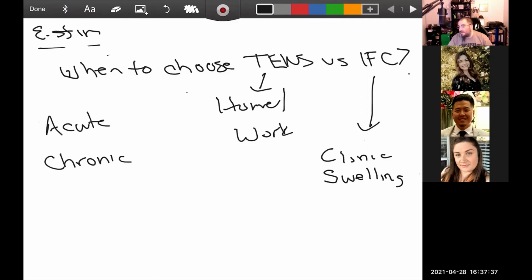So if you have an ankle and the only pads you have are big 2-inch pads, you theoretically could put TENS on with just two pads, or you can position them and move them around so you can get all four pads on. You get a little bit better result out of it. And the pads can be set up right next to each other, as long as there's even a little bit of space between them, you're okay.